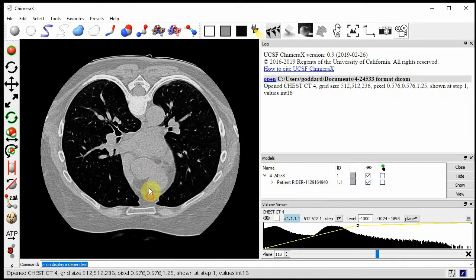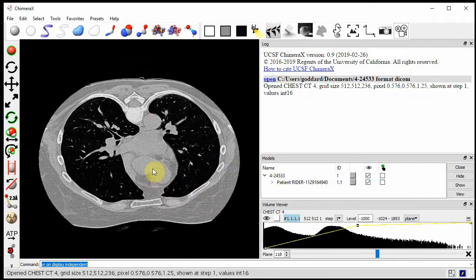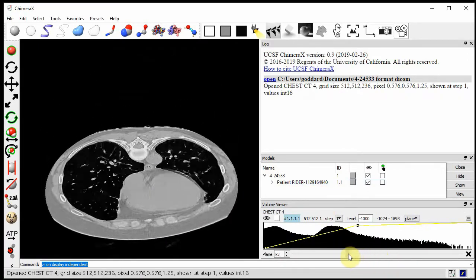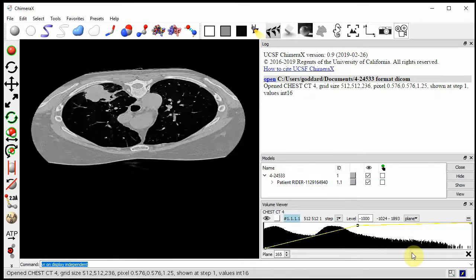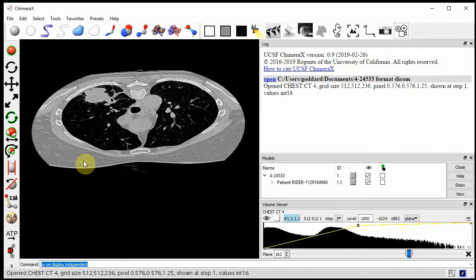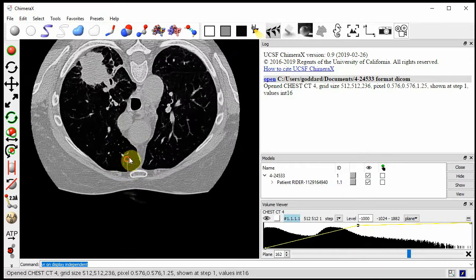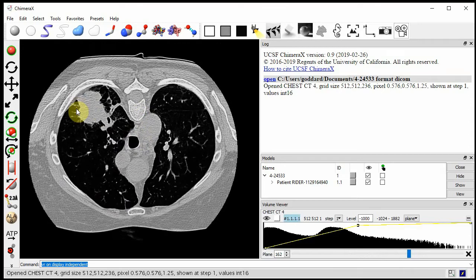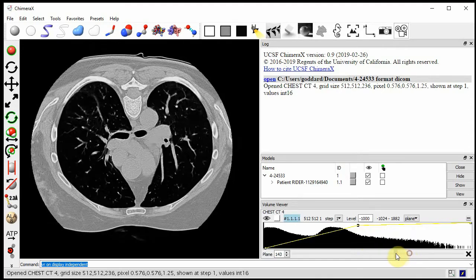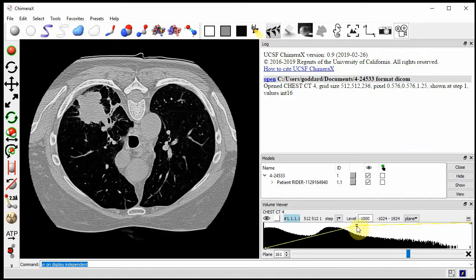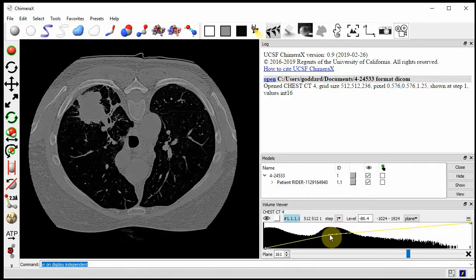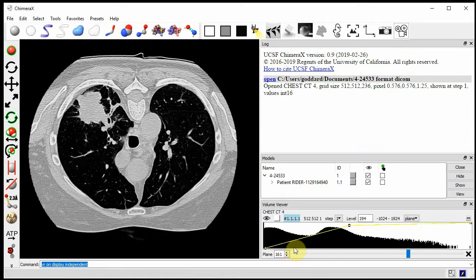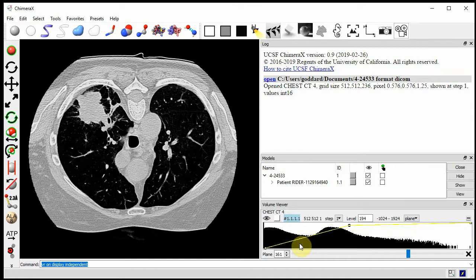It opens showing a single plane. I can move through the slices of the data. This lung has a tumor in the upper left-hand corner here. I can adjust the brightness levels by moving this yellow curve on the histogram of the data values. All of the things we can do in this tutorial can be done without the virtual reality headset using just the mouse and the desktop display, but my purpose is to show you how to do these things in virtual reality.